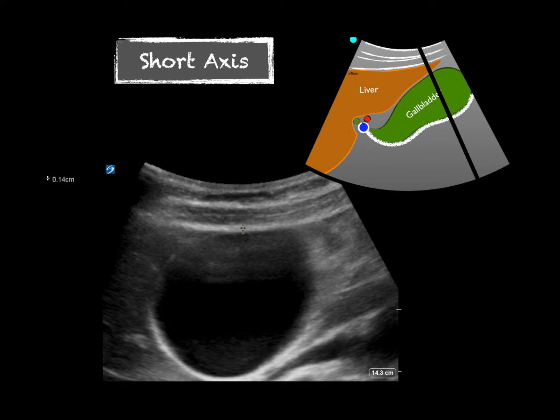And what happens with that is that we have something called attenuation, where the power or strength of the ultrasound wave or beam decreases as it passes through the soft tissues. Since the gallbladder is filled with liquid material, it will not lose that strength, and so the back wall will return a large amount of signal back to the ultrasound probe and confuse you if you measure that area. You won't be able to see it well. So make sure you're measuring the anterior gallbladder wall.